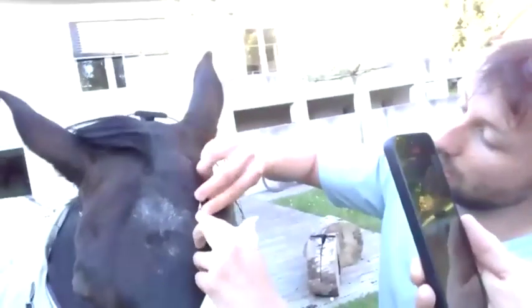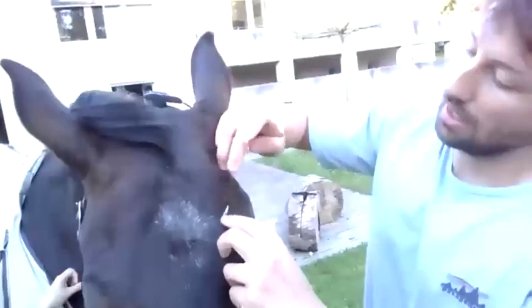As I mentioned before, I remove a bit of the hair and stick the electrode on, and without even using any other tape, I can just leave it like that. Of course, in the end, I can fix the electrodes or the cables with some tape, to have a more fixed setup. But like so, it's super easy and works pretty nicely.